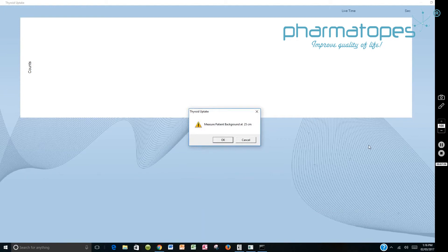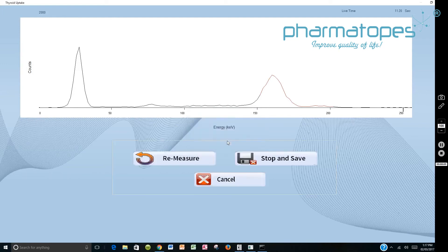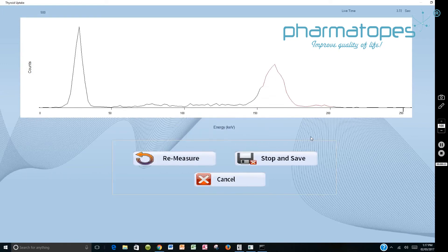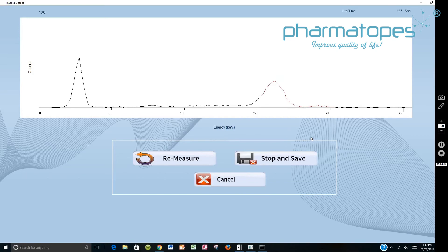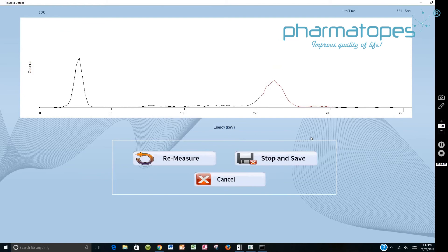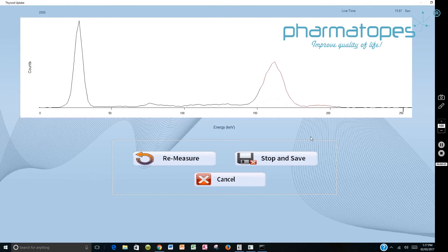And it says measure the patient's background. So we're going to measure the patient's background at 25 centimeters. So now we're measuring the patient's background at 25 centimeters. So we say OK to that. We begin the count. And this is the patient's background. And when you're counting the patient's background, you would expect to see some counts if you're counting over the thigh in an area similar in dimensions to the patient's neck. And this will count for one full minute.